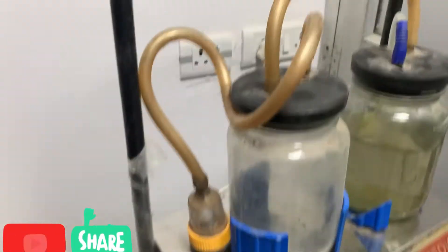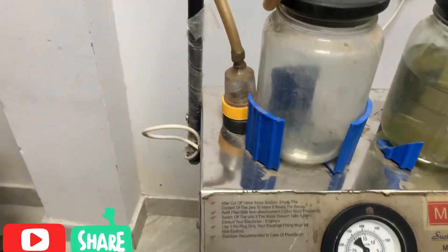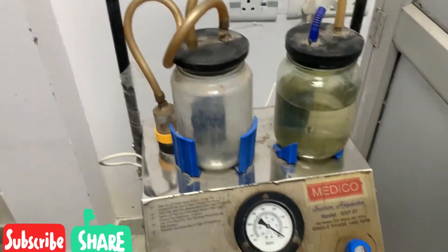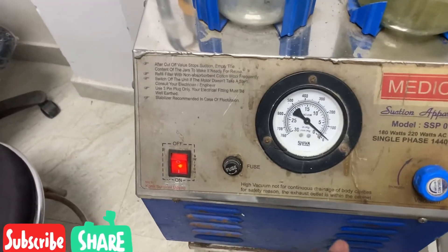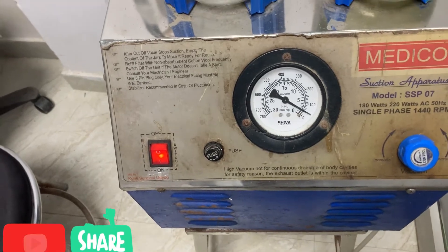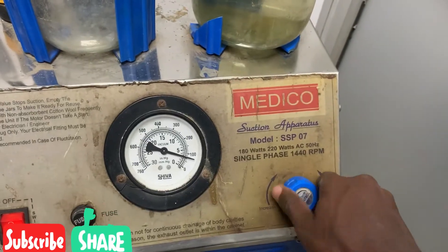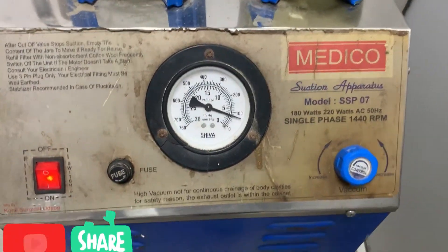Now let us turn it on and see. It is now plugged and we turn it on. As you can see, this is the pipe — let me test it if it's working. As you can see, now let us add the suction rate.